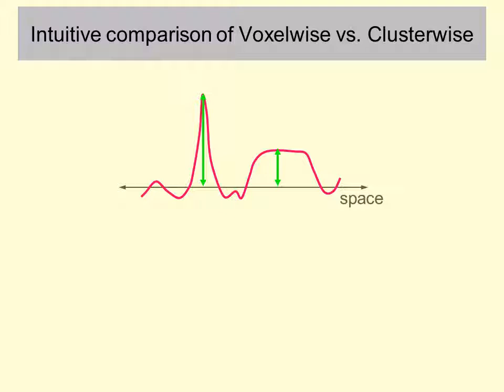Imagine taking a single coronal slice of the brain, then within that slice picking one particular value of y, one particular height, and just taking a strip of voxels from that coronal slice at that y value. That's where the data comes from, and the data points are z-stat values.